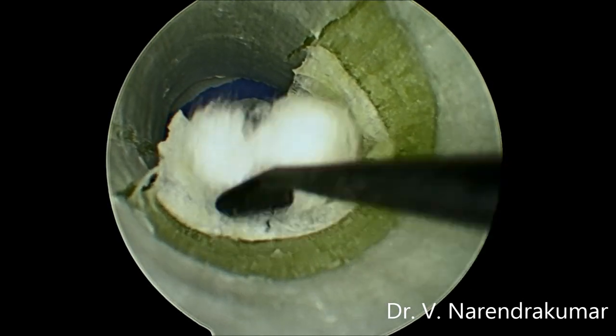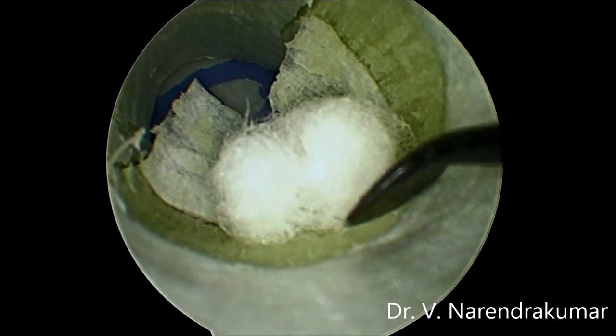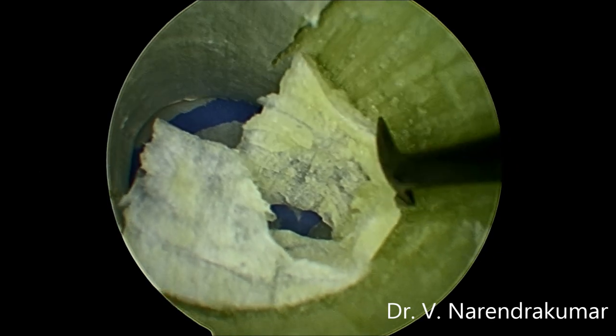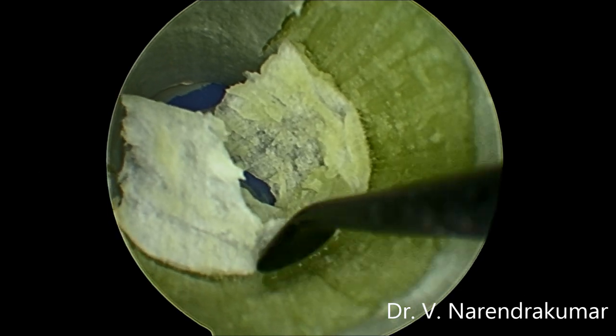Here, just for orientation, I am using a cotton ball also for elevating the same, as we do in surgeries. This gives a very beautiful picture under the endoscope.